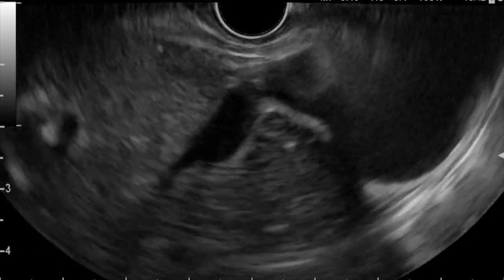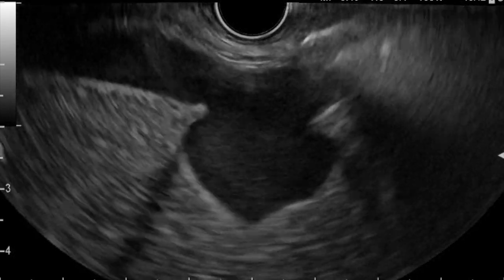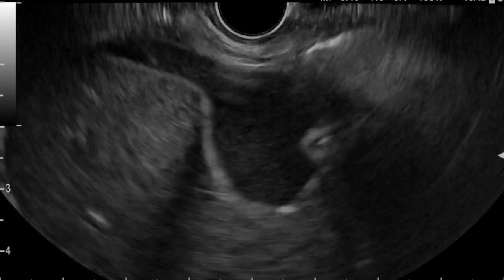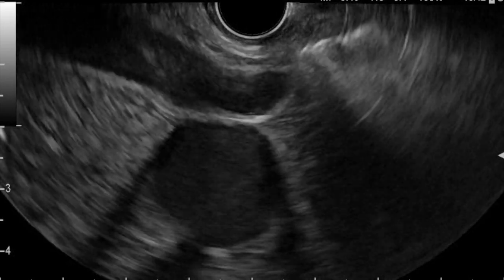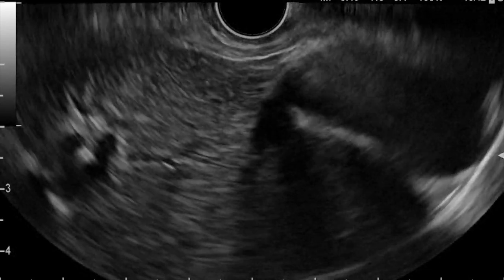Both the middle and left hepatic veins are good candidates for cannulation. The origin of the right hepatic vein can also usually be seen. However, to cannulate this, one would usually have to cannulate through the IVC. When cannulating, it will always be safer to traverse through as much liver parenchyma as easily possible.